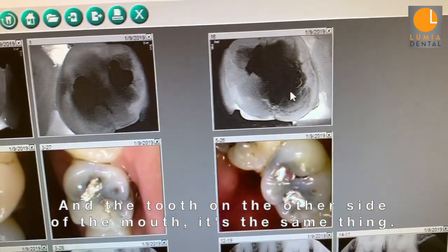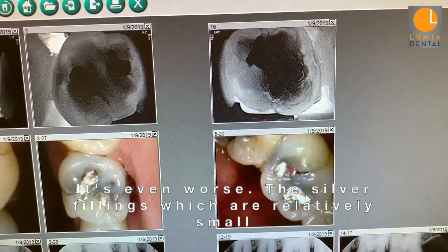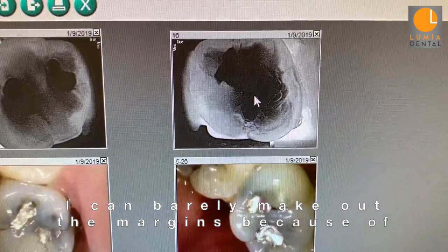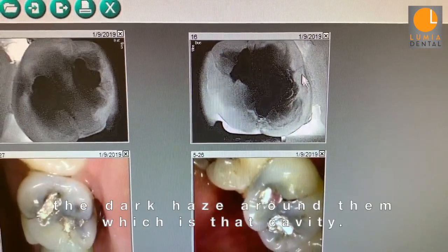And the tooth on the other side of the mouth — same thing, it's even worse. The silver fillings, which are relatively small, I can barely make out the margins of them because of the dark haze that's growing around it, which is that cavity.